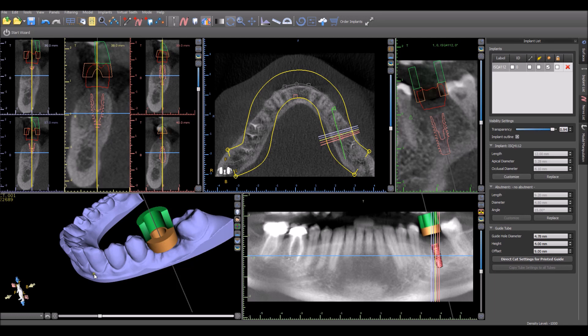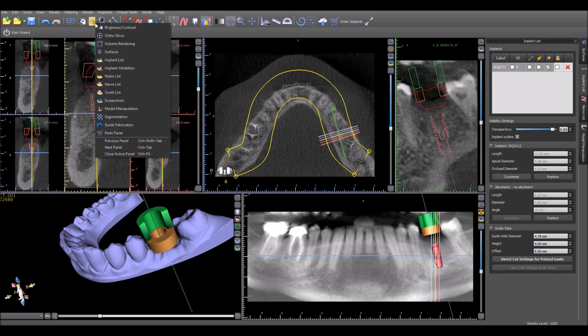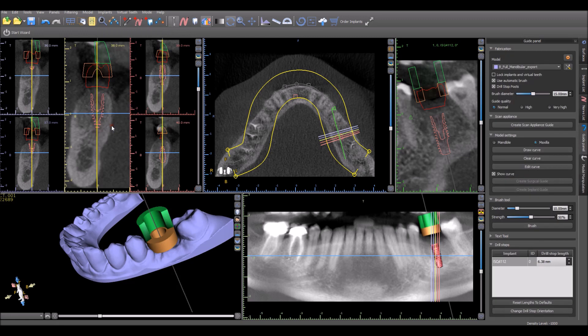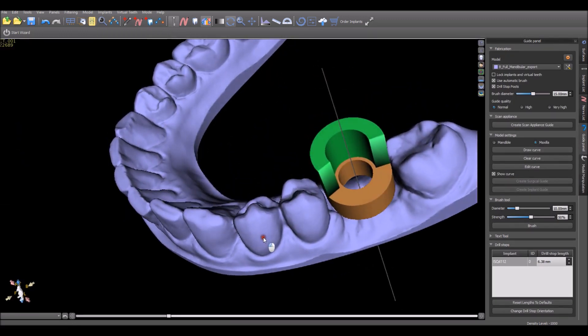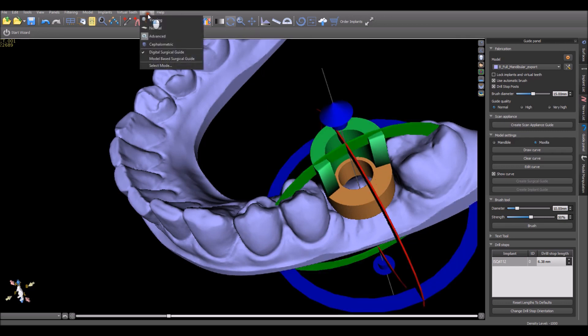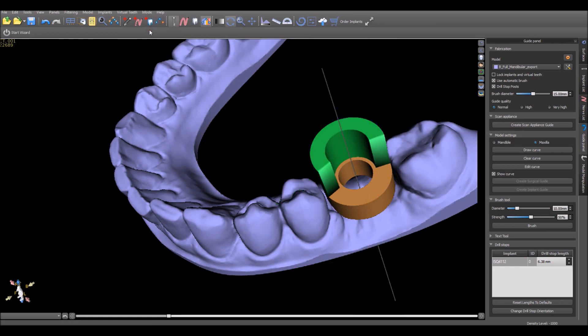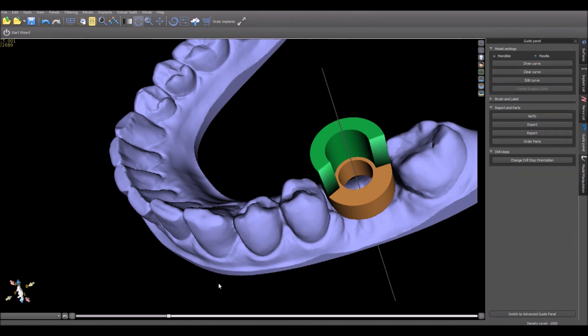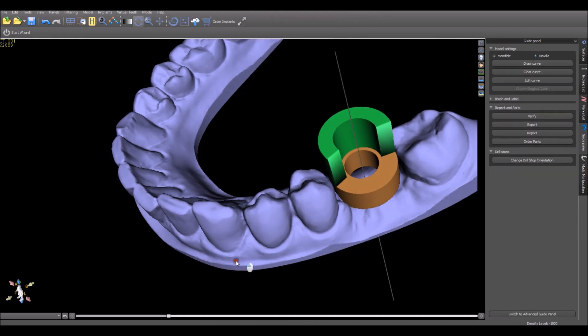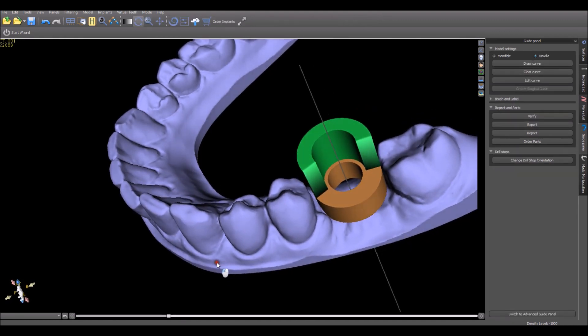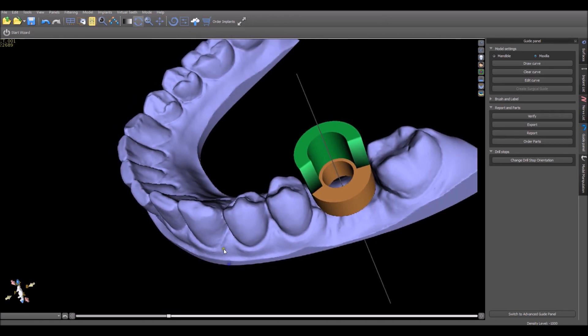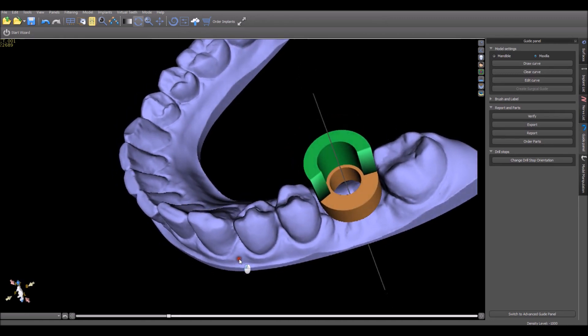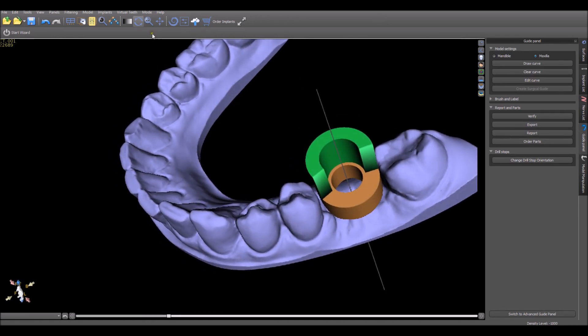We're going to open up the Guide panel. We're going to enlarge our 3D view so we have good visibility. We're going to show this process flow in Normal mode. We have modes up here, assuming that you're using the Blue Sky Bio direct cut drills and the handpiece. We also recommend using the X-Cube handpiece, but we'll see we have the option to modify that. Okay, being in Normal mode, we have a very simple panel. Essentially, we draw the curve.